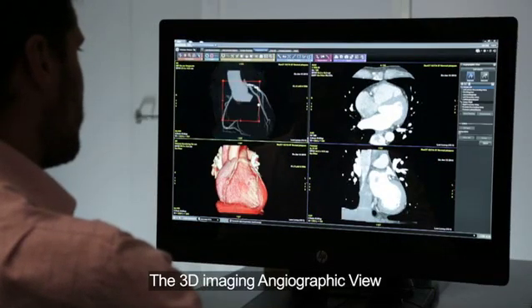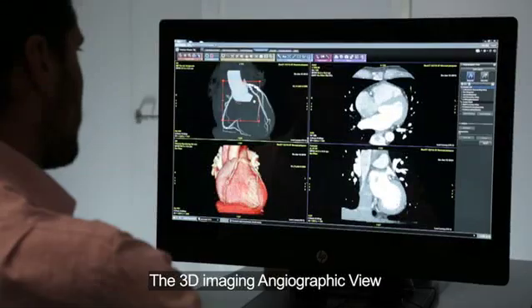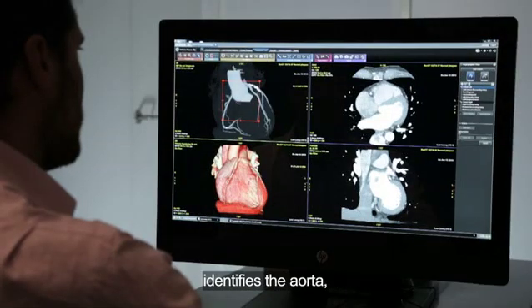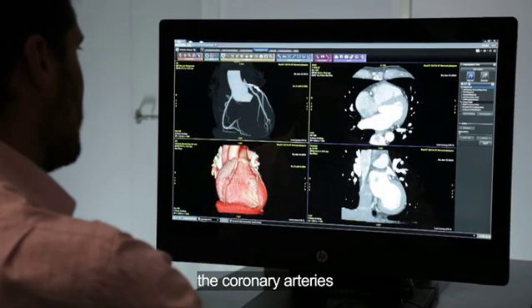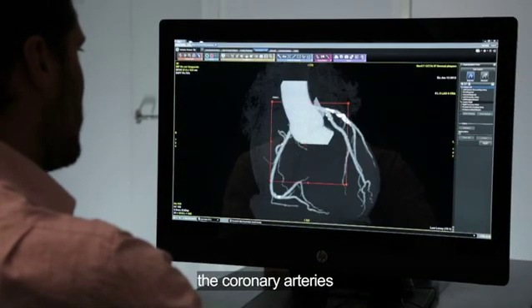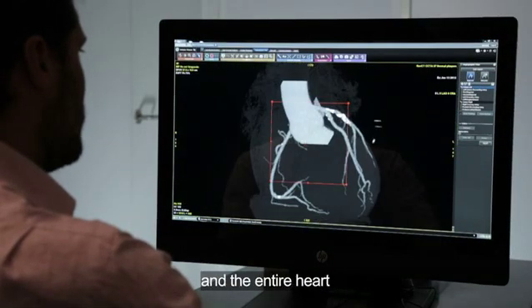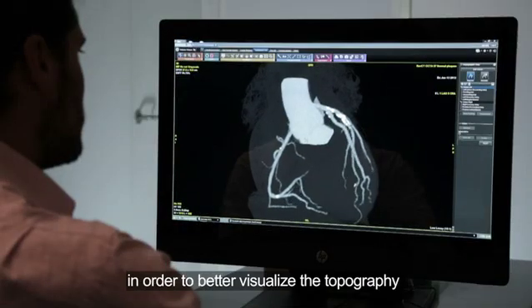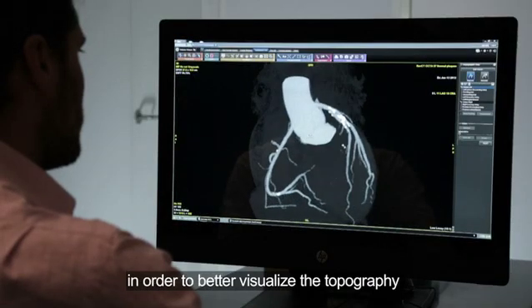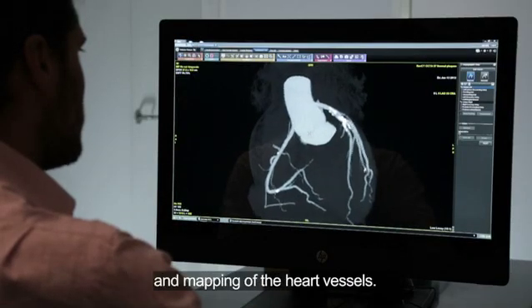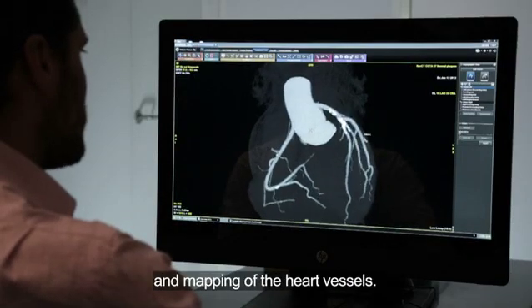The 3D imaging angiographic view identifies the aorta, the coronary arteries, and the entire heart, in order to better visualize the topography and mapping of the heart vessels.